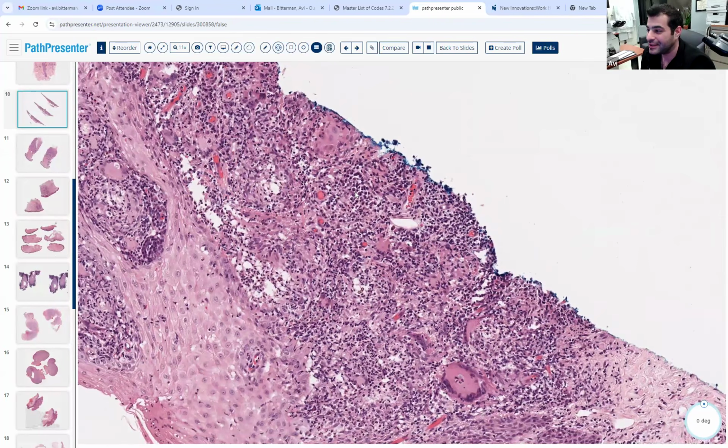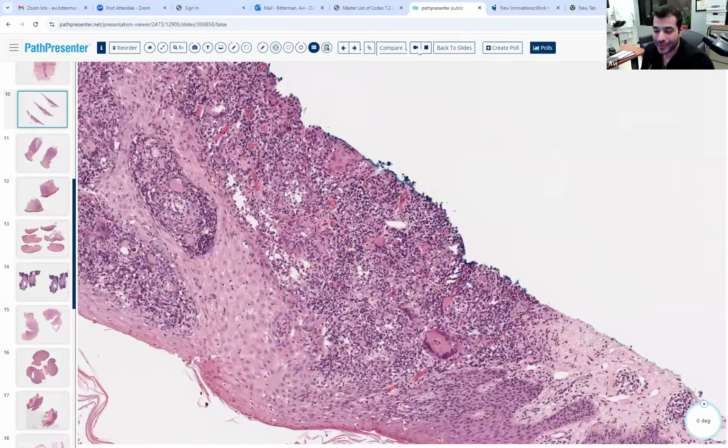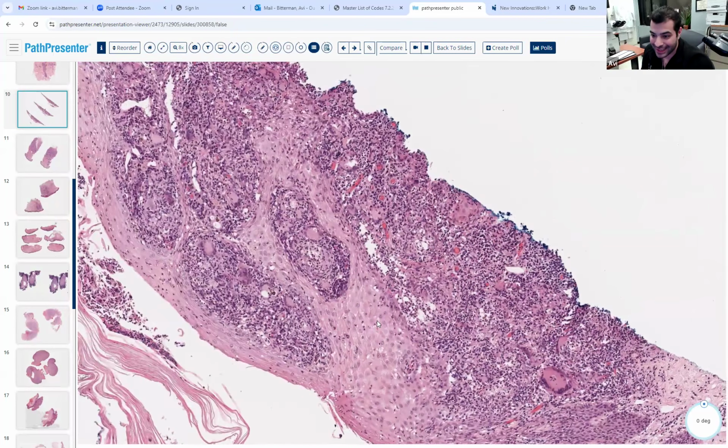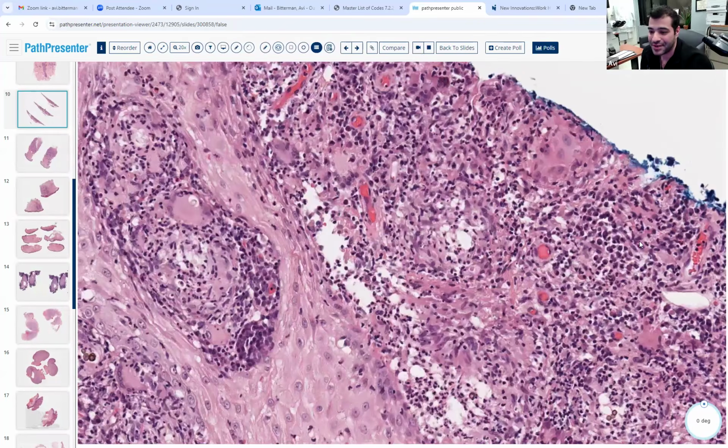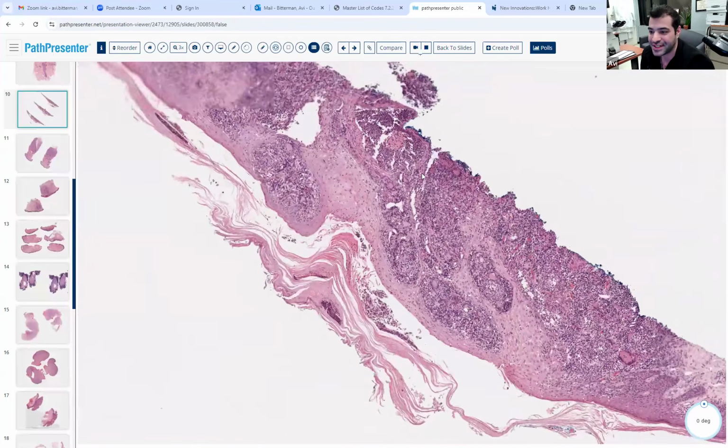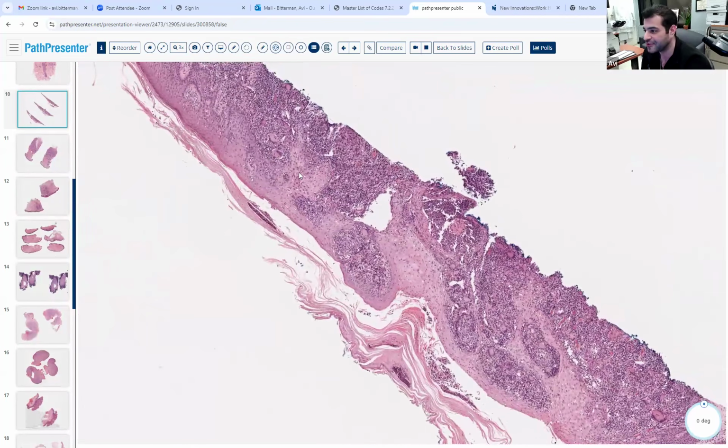By the way, this type of appearance, this glassy keratinocytic appearance and neutrophils, can happen in KAs, right? Because remember, KAs have those neutrophilic microabscesses. But when you see this, you have to think of some kind of infection. Where are the high yield parts? If you see this, where are we going to really look for infections, if we're looking for bugs?